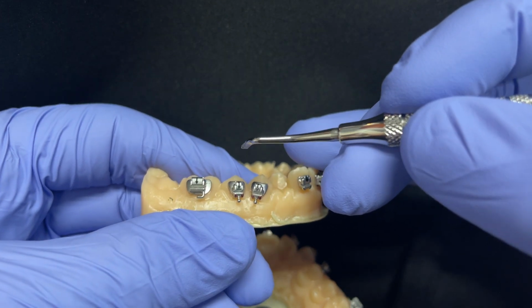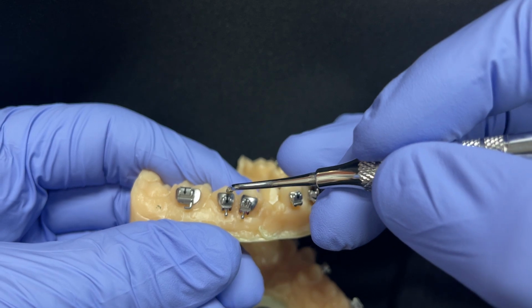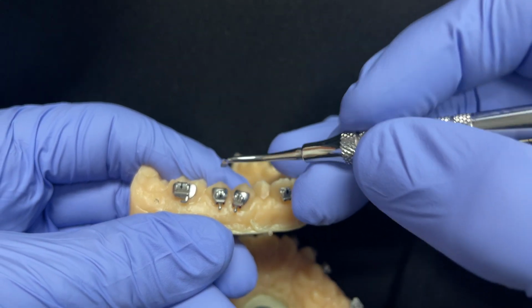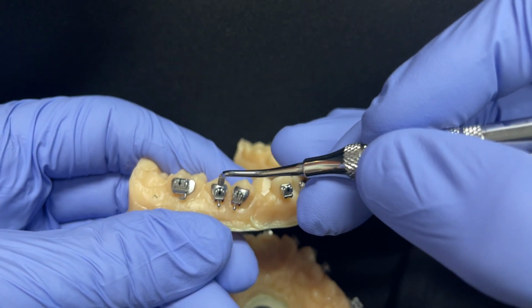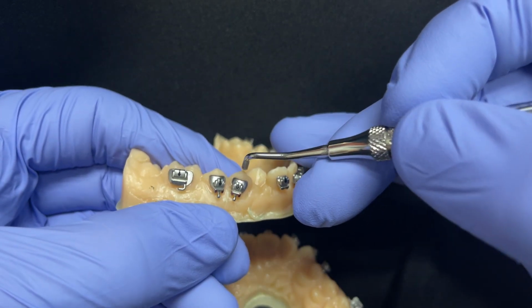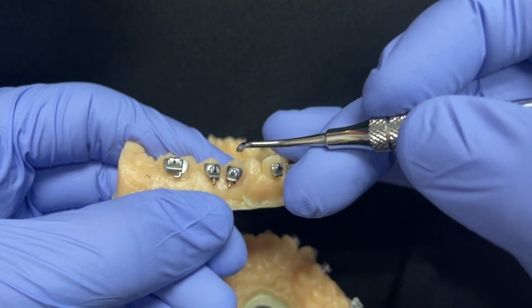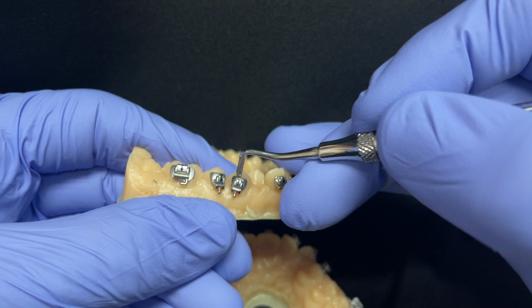And one little cue here is just looking at the amount of enamel that's exposed from the edge of the premolar bracket to the tip of the premolar. Whatever this is, we want to have just a little bit more than that on the 4.